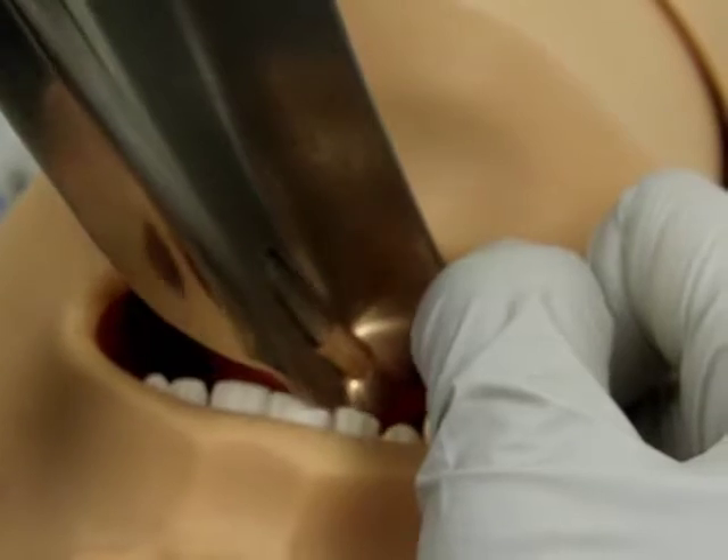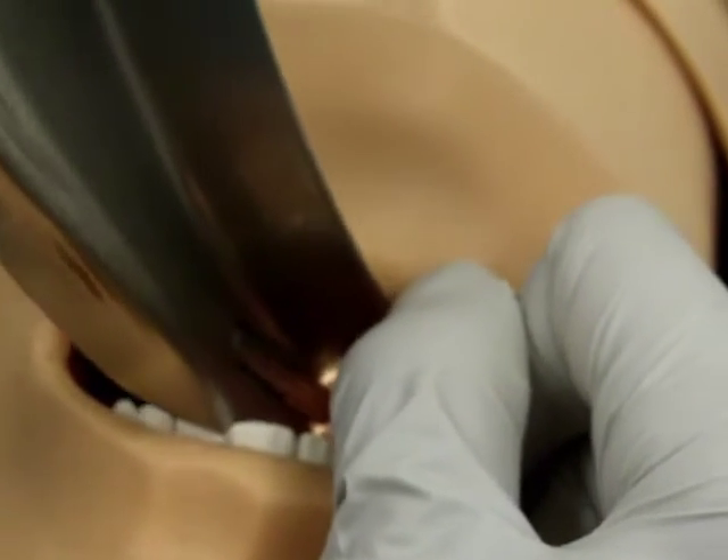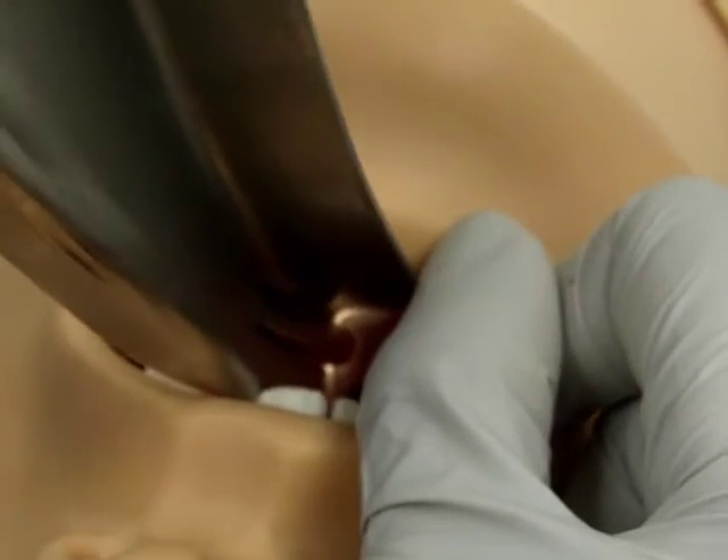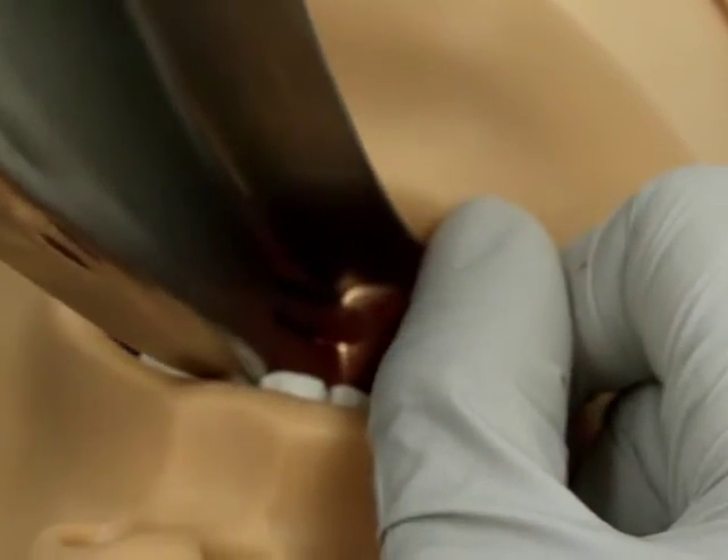Sweep the tongue to the left side of the mouth. Use caution when advancing the laryngoscope blade to prevent injury to the teeth and to prevent entrapment of the lip or tongue.